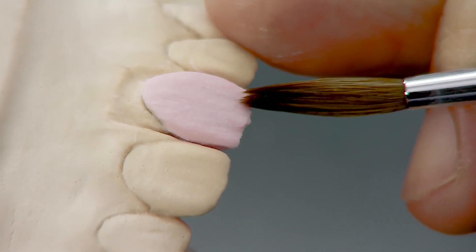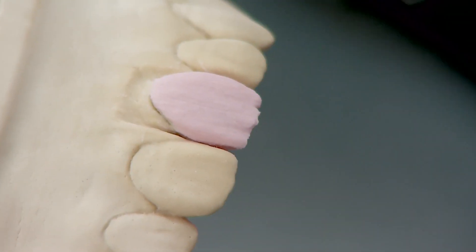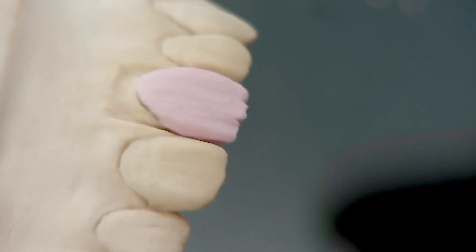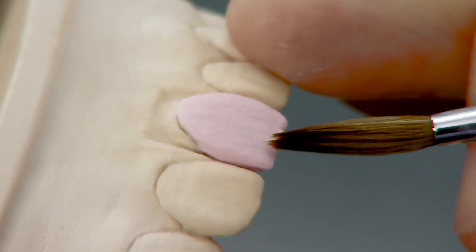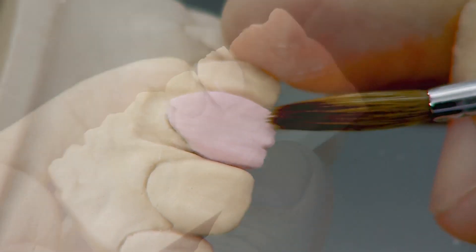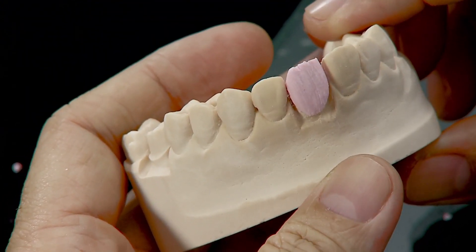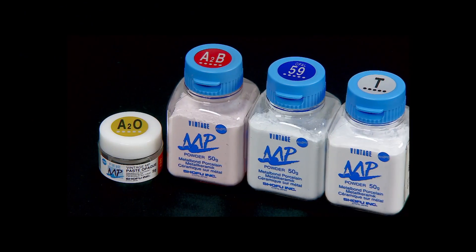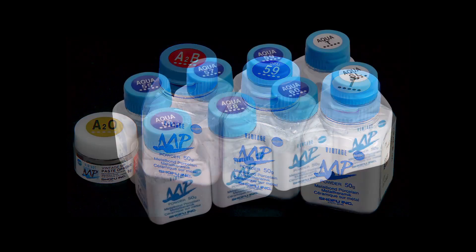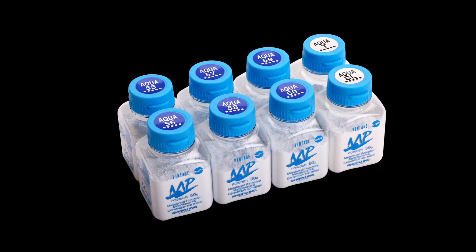Flatten the brush tip and create finger-like structures at the incisal area to mimic the mamelons. The dentin layer is now complete.